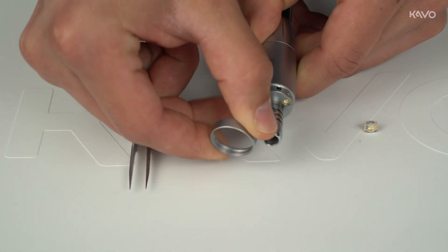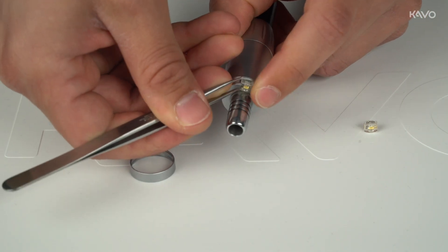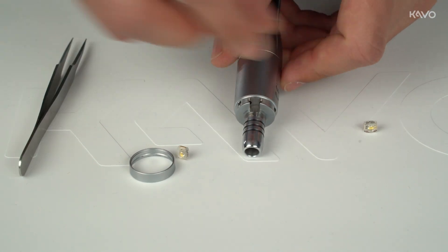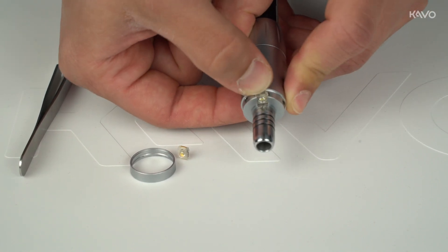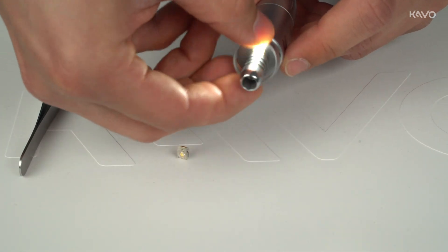Remove the ring from your micromotor. Then use tweezers to press the LED out of its socket. Insert the new light source with a visible CAVO logo into the socket by hand. Finally, put the ring back on.